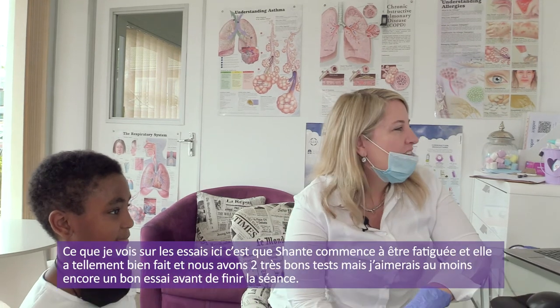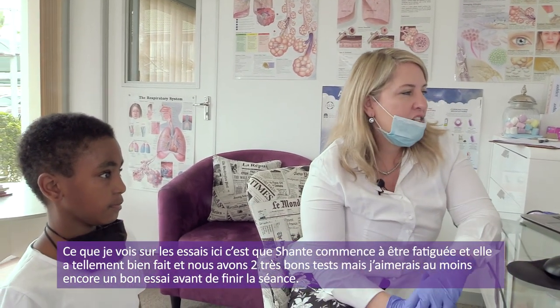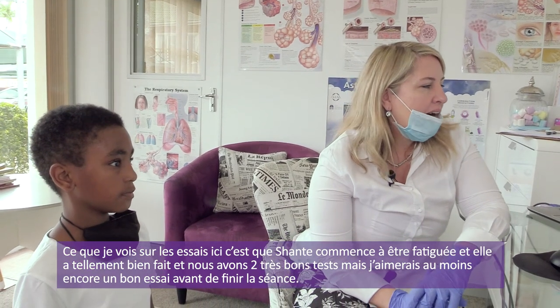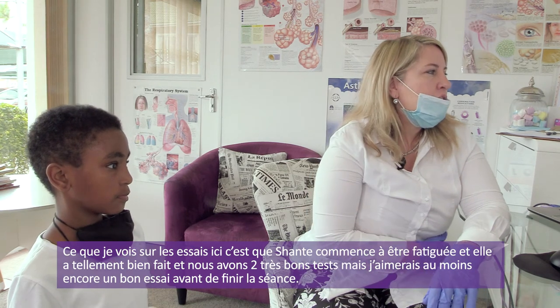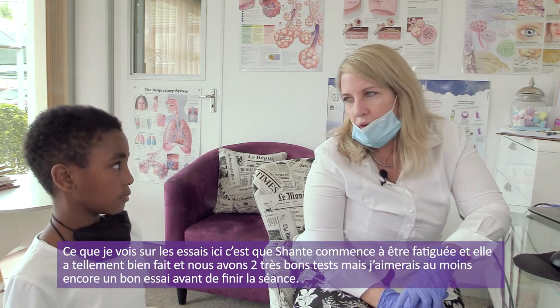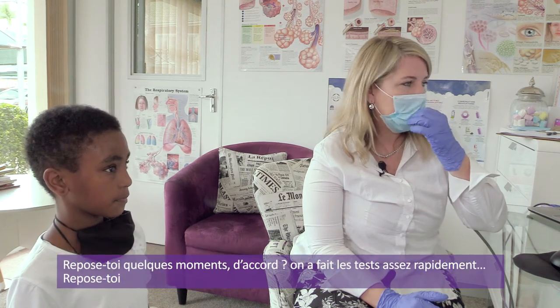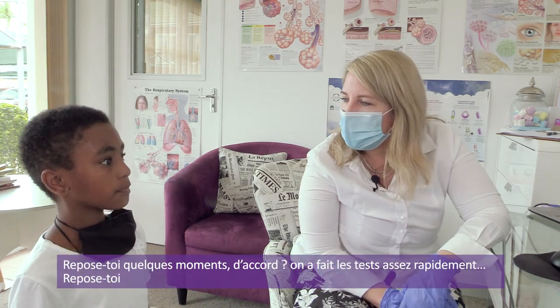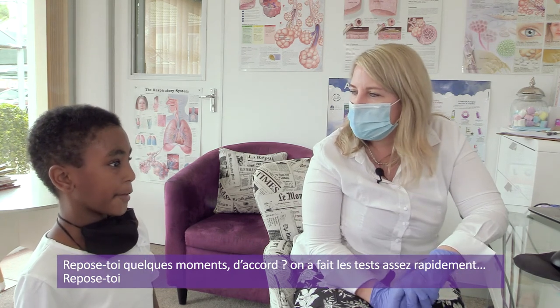A little bit, yeah. So what I can see on the blowing here is that Shanti is getting tired and she's done so, so well. And we do have two very good tests. But I would like to just record at least one more good blow before we finish the testing session. All right. Okay, so just take a few moments, okay? We've done them quite fast, so just rest for a moment.